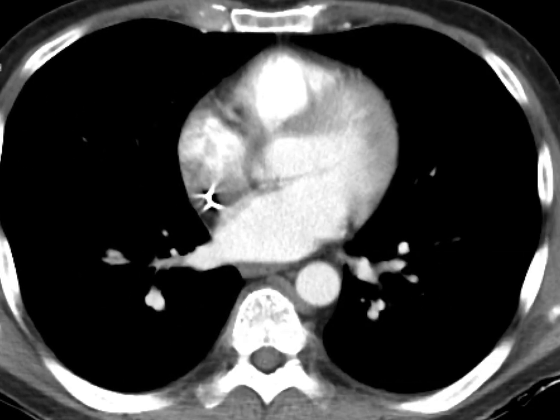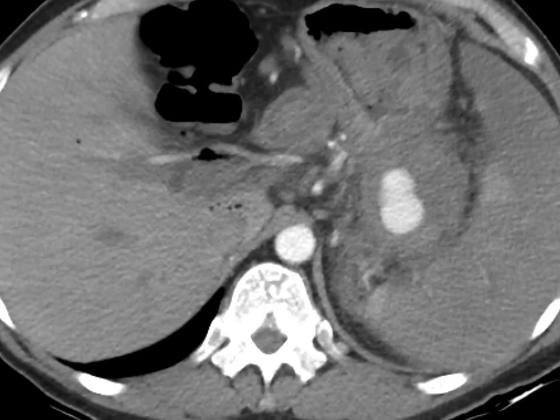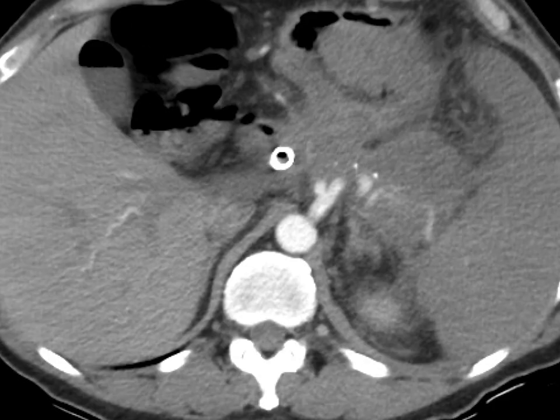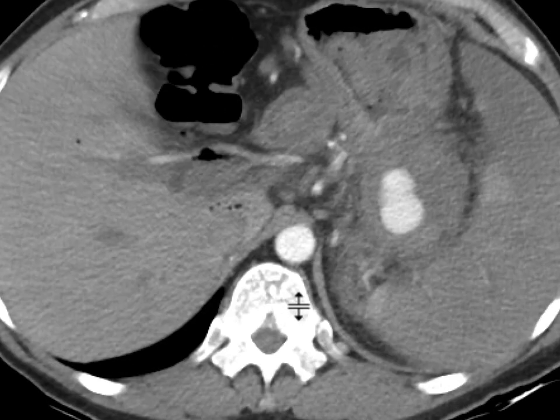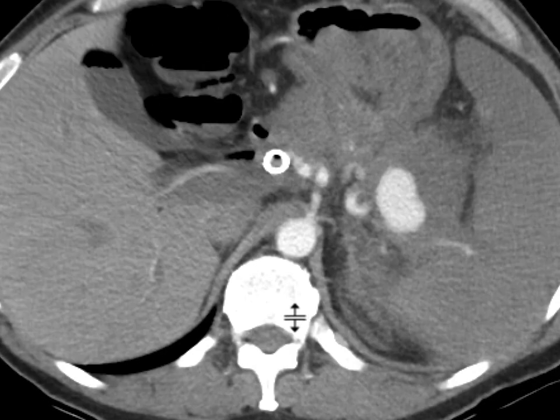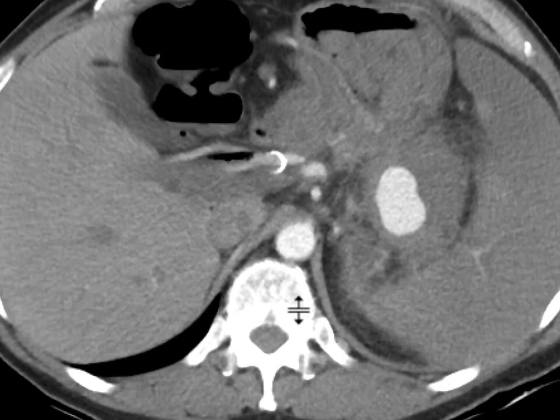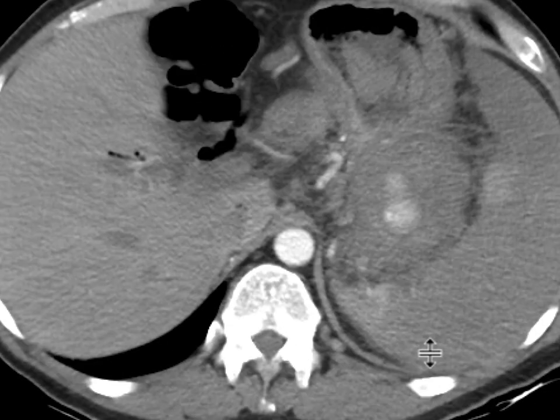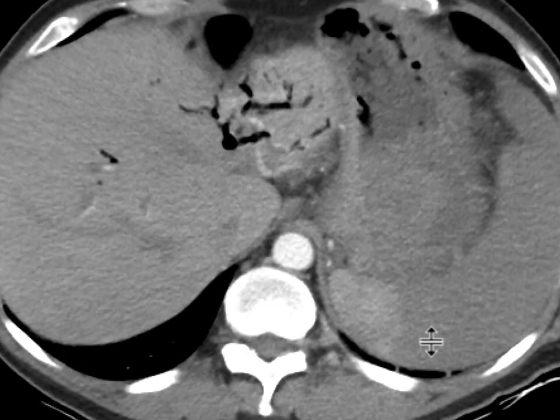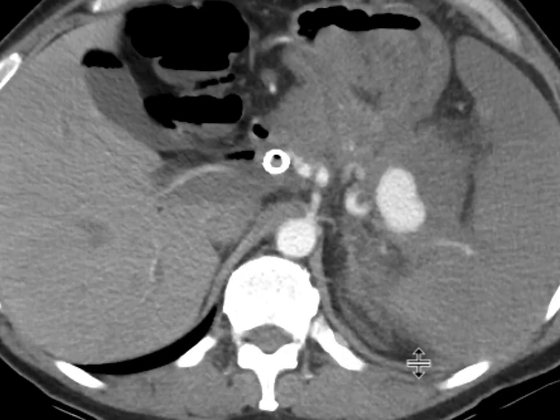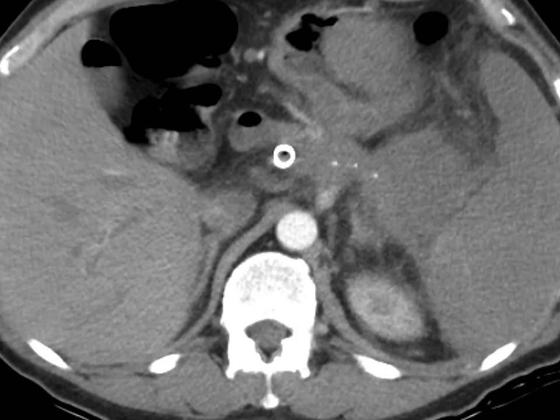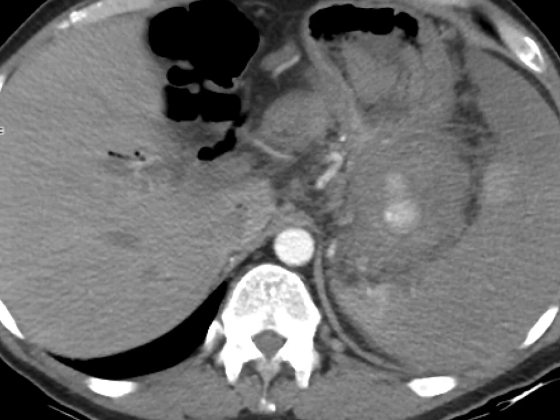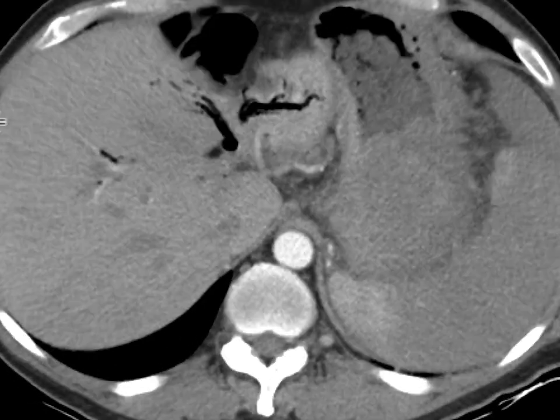As we go down to the arterial phase, we can see almost immediately this large contained collection of contrast connecting to the splenic artery — and so this is a splenic artery pseudoaneurysm. There is some hematoma surrounding it, and presumably some of that has eroded into the stomach, resulting in the blood products and the melena that is being observed clinically.